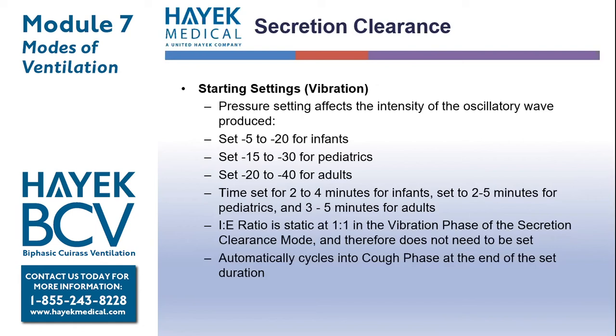The IE ratio is static in the vibration phase of the secretion clearance mode and therefore does not need to be set. It automatically cycles from the vibration phase into the cough phase at the end of the set duration.